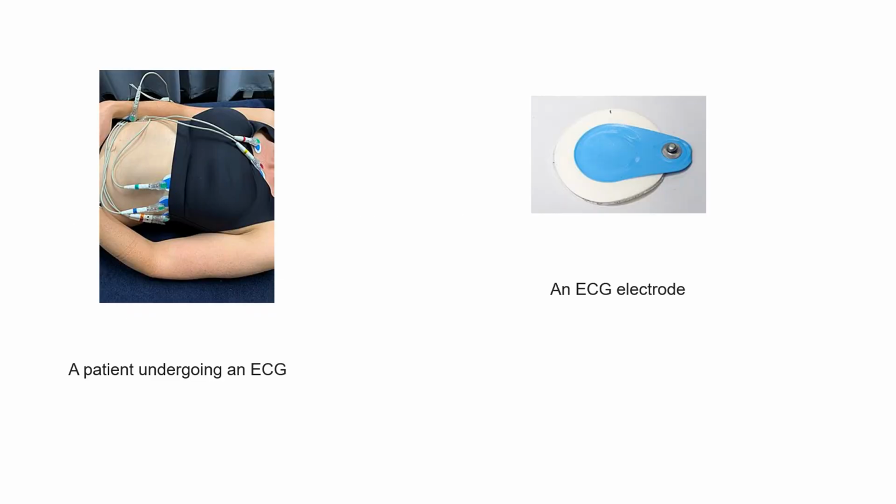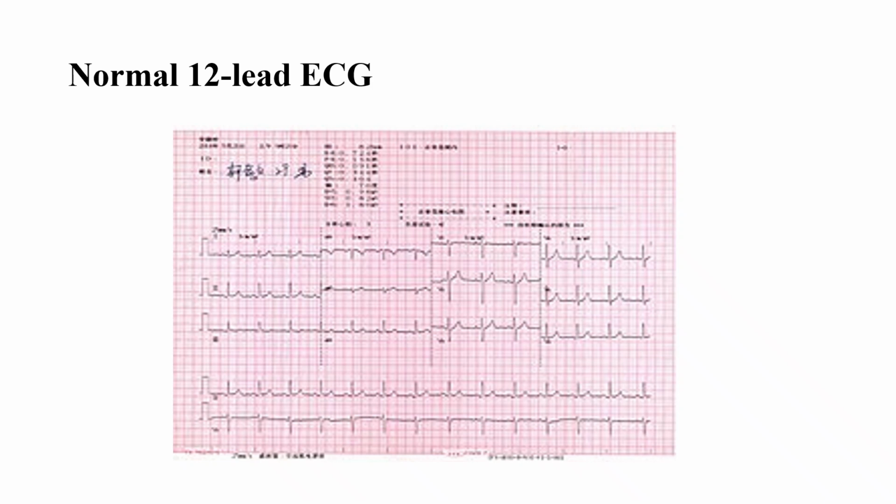These are the patient undergoing ECG connection. These are the ECG electrode. This is normal 12 lead ECG waveform.